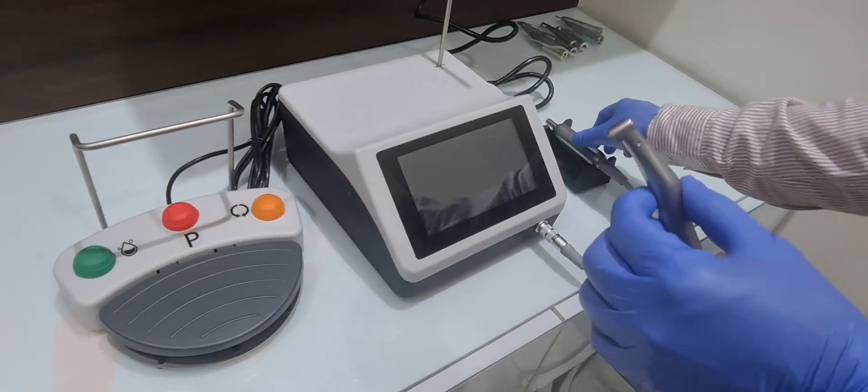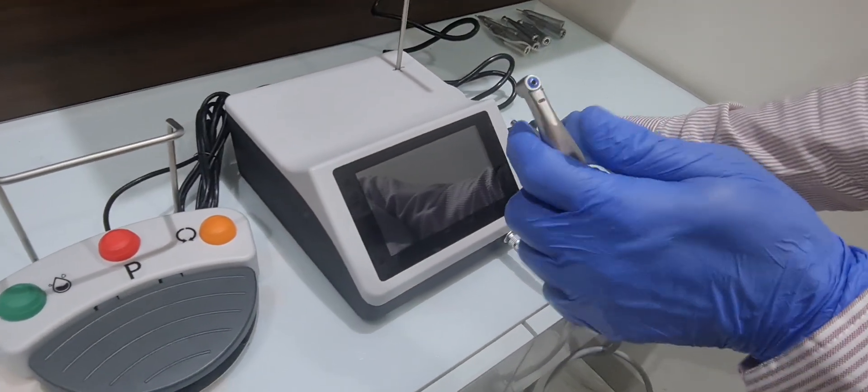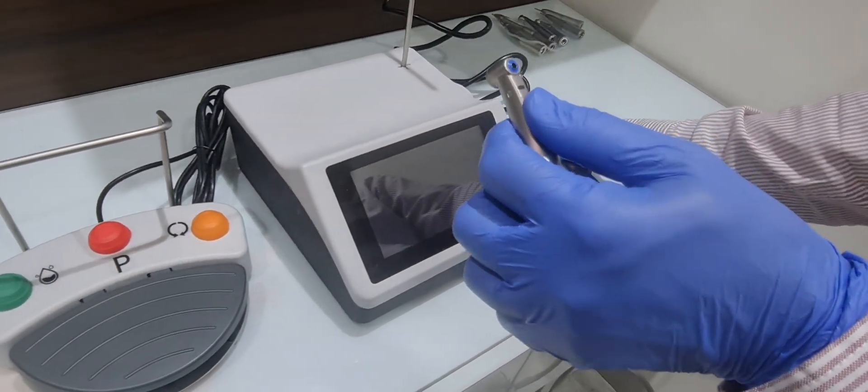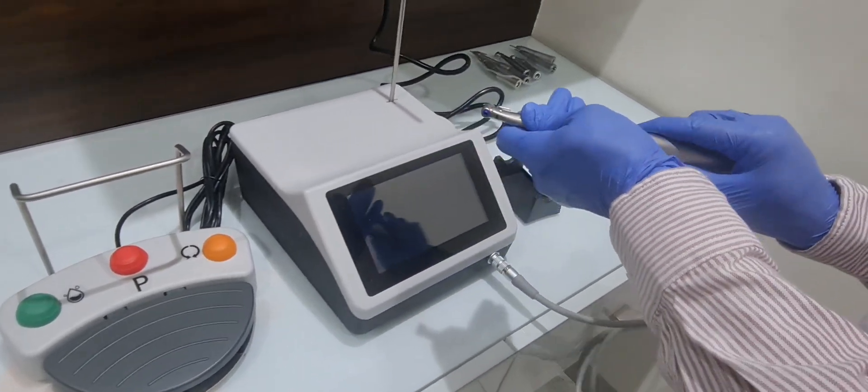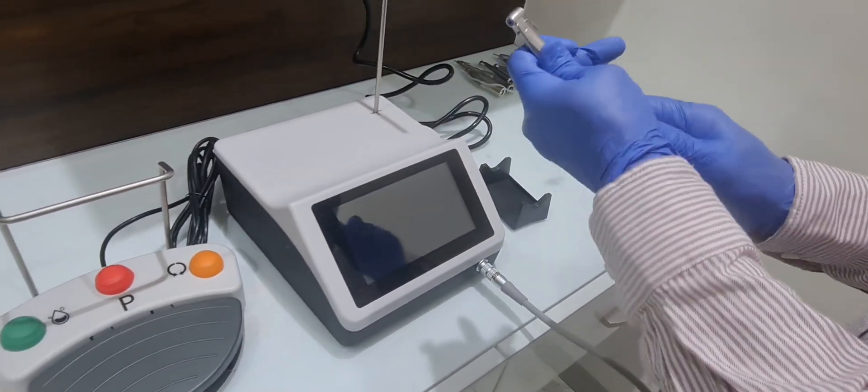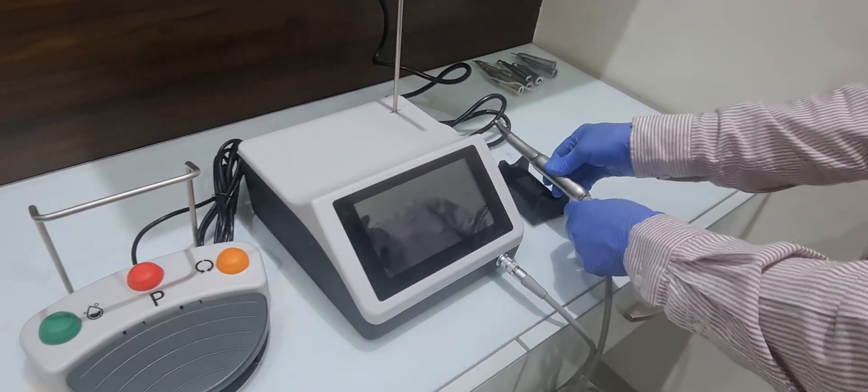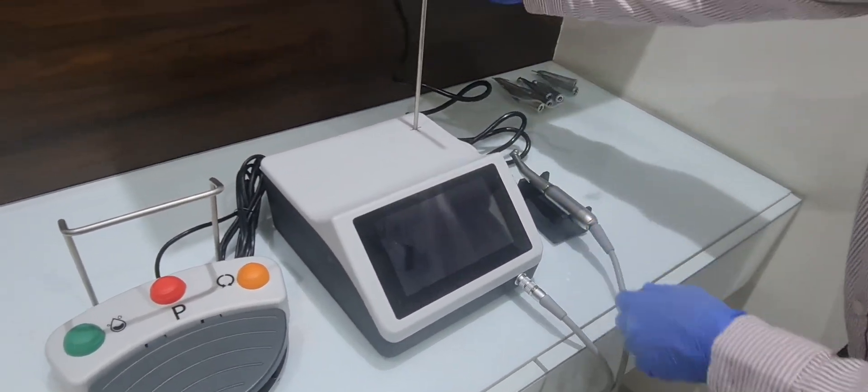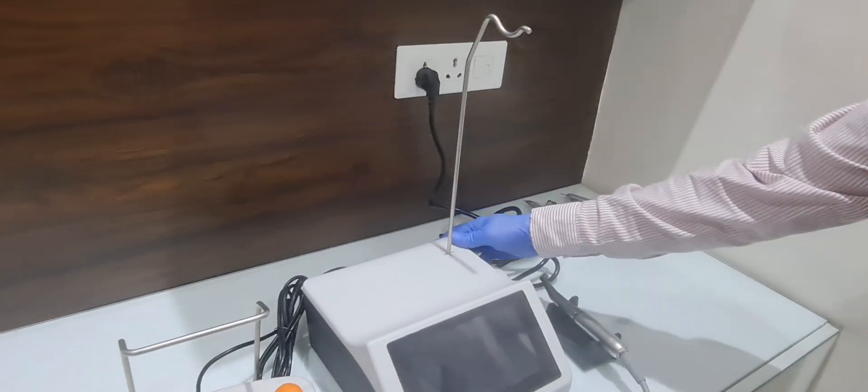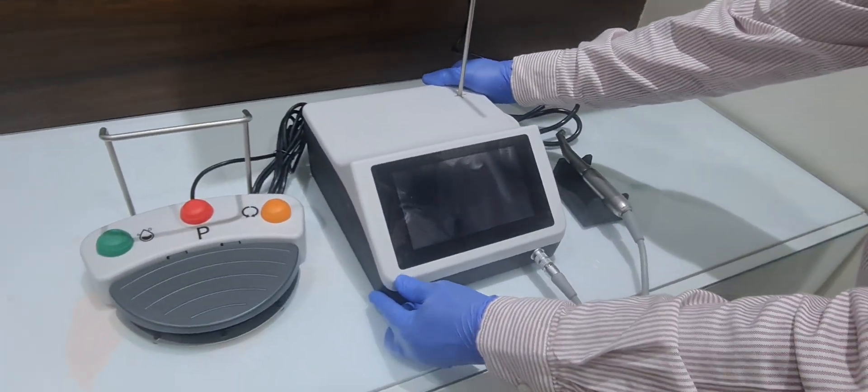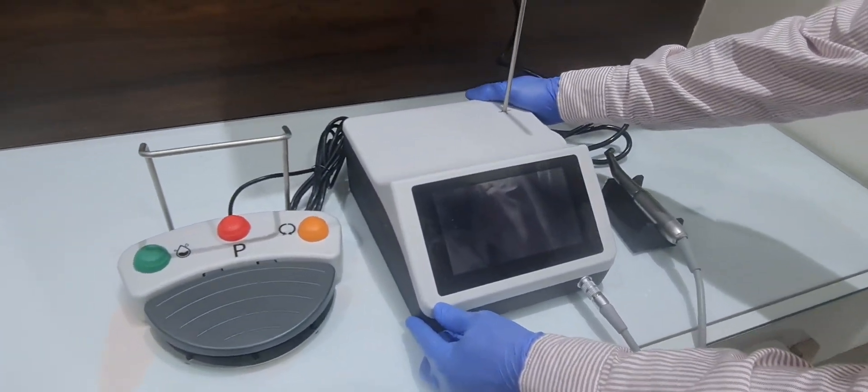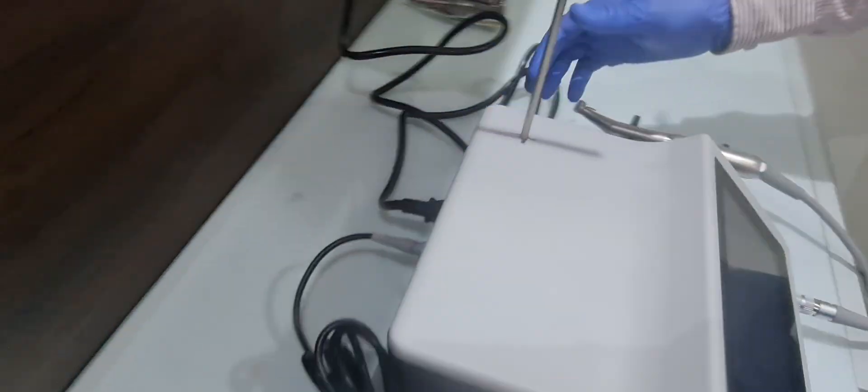It comes with a 20:1 fiber optic implant handpiece. Behind there is a power switch, you can switch it on.